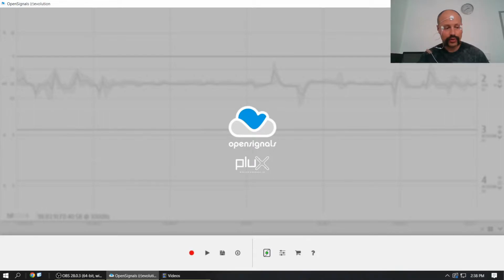Software in order to record the EOG or electrooculogram and to check if we obtain the signal as expected. The expected polarity of the response is positive for the saccades on the right and negative for the saccades on the left.